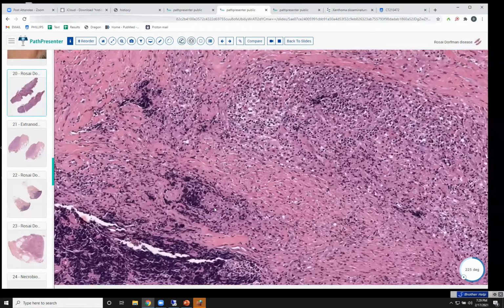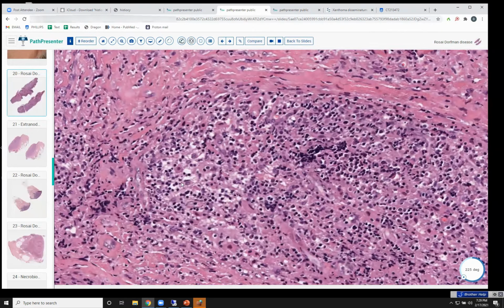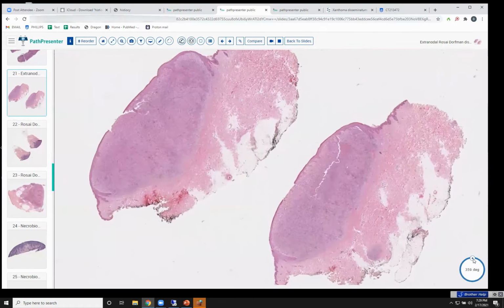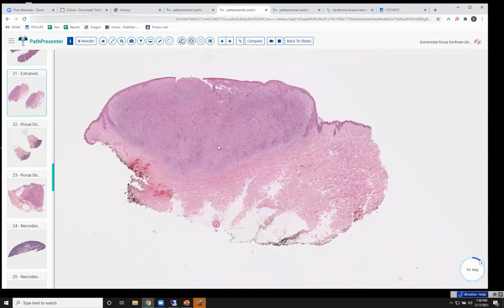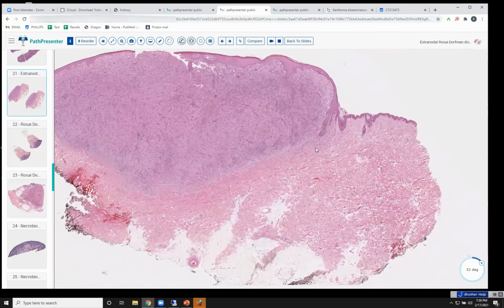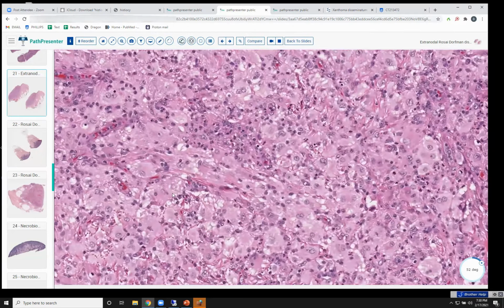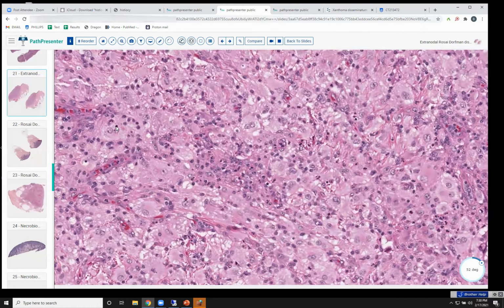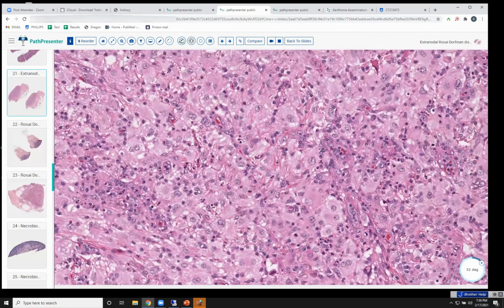And often a very dense lymphoid infiltrate over here. You can see. And then here you can see these cells with the engulfed lymphocytes, these little blue ones. Just going to show a few more of this because this is a useful one to know. Again, on low power, you see the lighter areas and the darker areas, and this well-defined nodule, no epidermotropism. You go on high power, you see these are all histiocytes. And here you can see nicely these neutrophils, lymphocytes, all inside the cytoplasm of the histiocyte here as well.